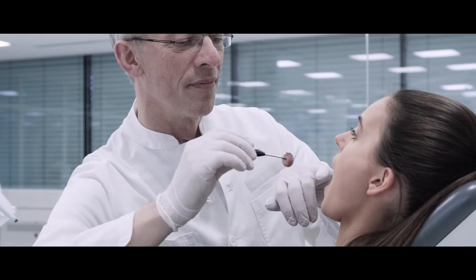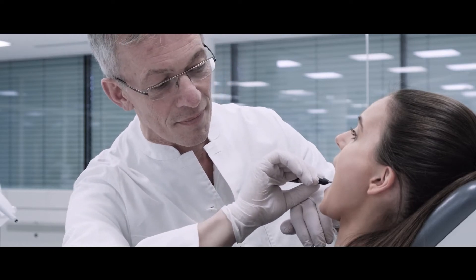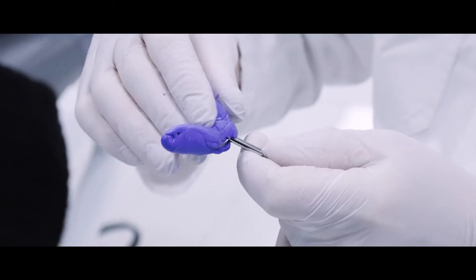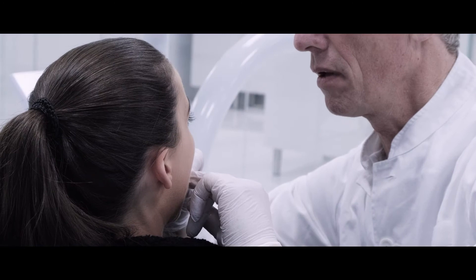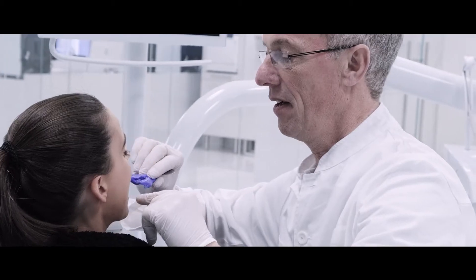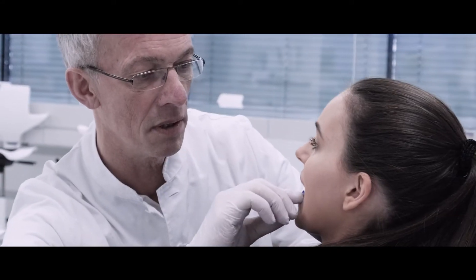Working with Zirconzon's digital workflow, the dentist starts with the analysis of the patient and the acquisition of impressions by intraoral scanner. Following the recording protocol, the doctor digitizes the two arches. Together with intraoral scans, he also registers a fork necessary for the acquisition of mandibular movements.